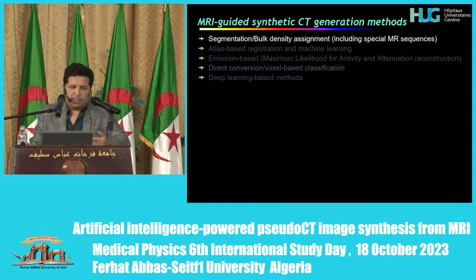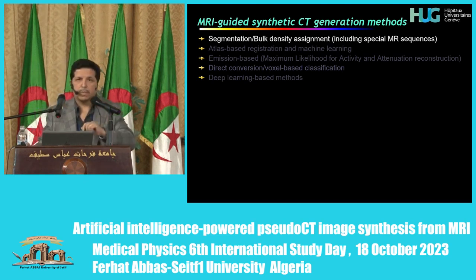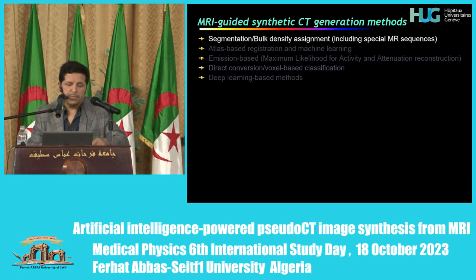More recently, some of the manufacturers focus on developing special MR sequences which depict the bony structures, because in the conventional T1, T2 weighted sequences, there is ambiguity between air and bony structures. It's very difficult to distinguish them. Those ultra-short echo and zero-time echo sequences enable you to nicely depict the bony structures. So you can easily synthesize a pseudo-CT image from the acquired MR. And this is a nice illustration from this recent review paper.